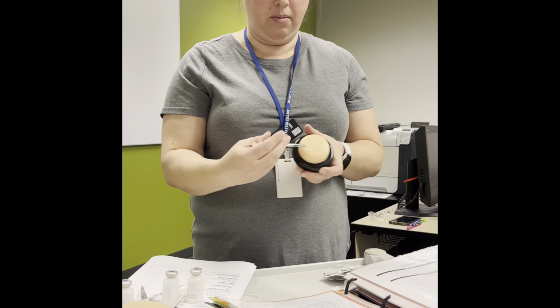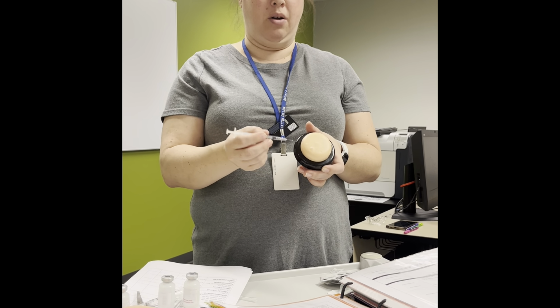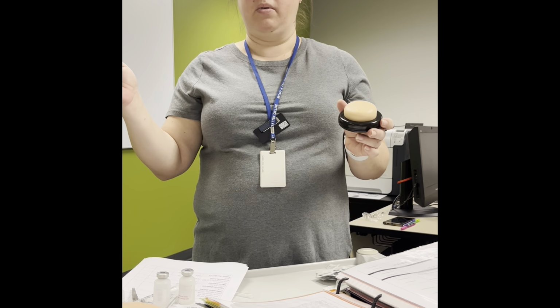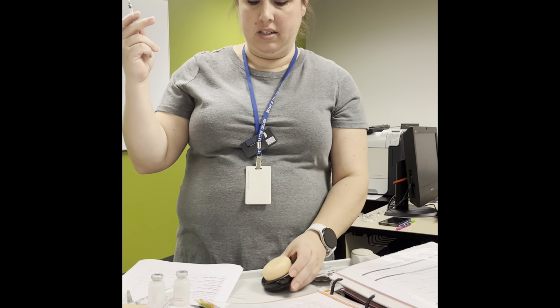You can't really see mine, but sometimes you'll get a little bubble that's already in the pad, and you're just gonna pull it straight out. Sometimes it leaks right out of the pad. Sometimes it'll spray back out at you, or it pops. That's fine. We're gonna then take this.